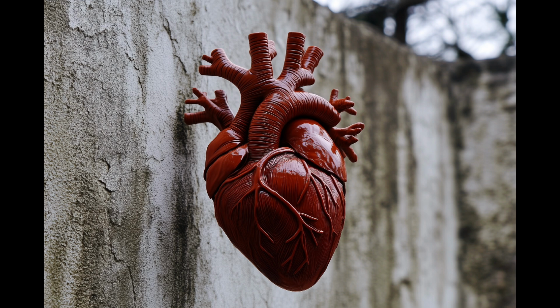level. Right, and that lower PO2 wouldn't necessarily be a problem with their lung function, but more like a normal adaptation to the lower partial pressure of oxygen at higher elevations. It's a good reminder that interpreting ABGs isn't always black and white. We have to think about the context, the individual patient, and their specific situation. Absolutely. It's about looking beyond just the numbers and seeing the bigger picture.